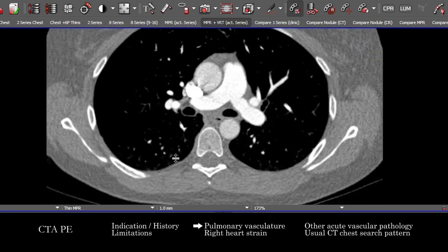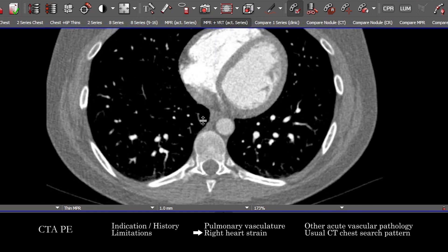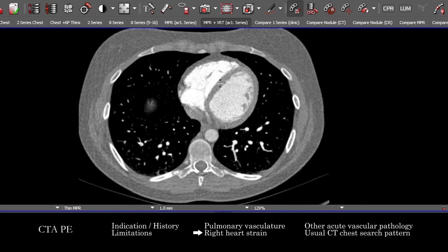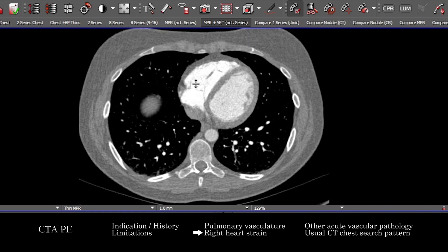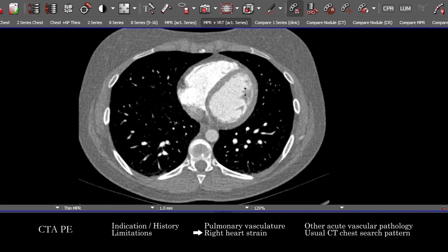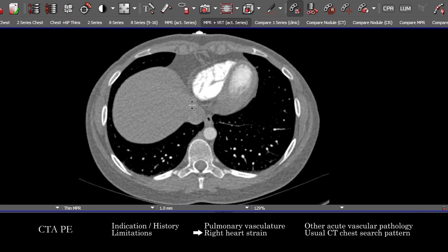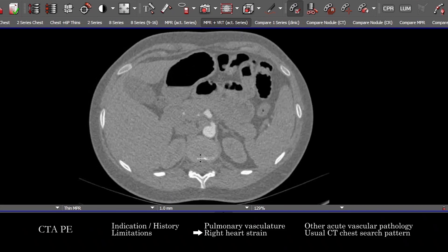Having searched for pulmonary emboli, we're going to look for secondary signs of right heart strain or CT evidence thereof. We assess the relative caliber — the relative size of the right-sided heart chambers compared to the left, specifically the width of the right ventricle to the left ventricle. We also look for reflux of contrast into the IVC and hepatic veins.